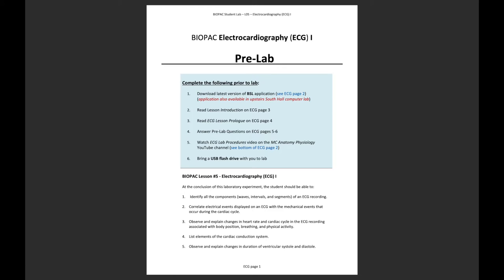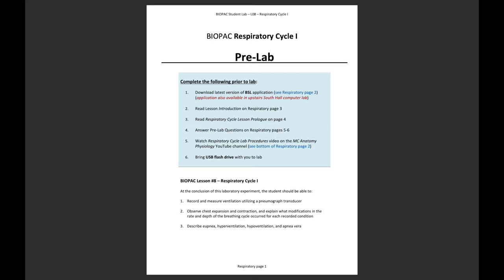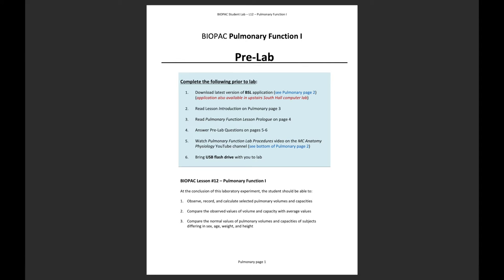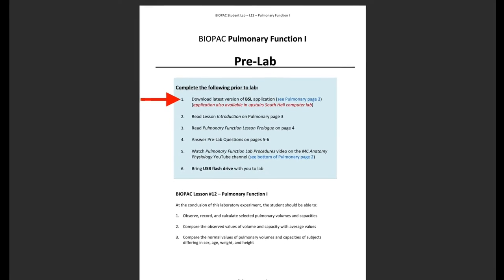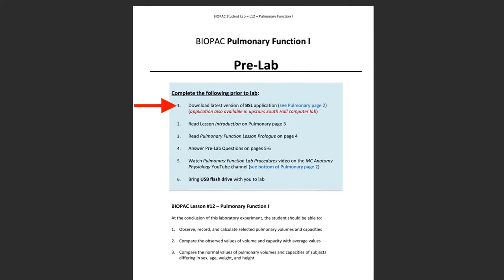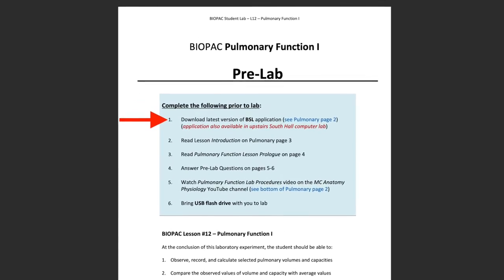The first step of every Biopac pre-lab, whether it's the ECG, EMG, respiratory cycle, or pulmonary function lab, asks that you download the latest version of the free Biopac Student Lab, or BSL, application.